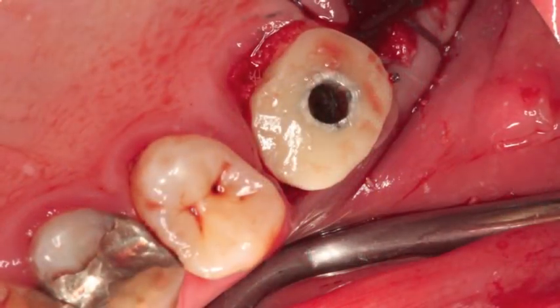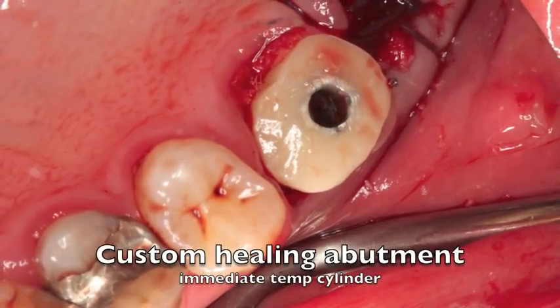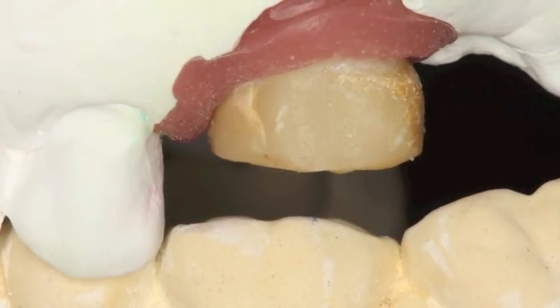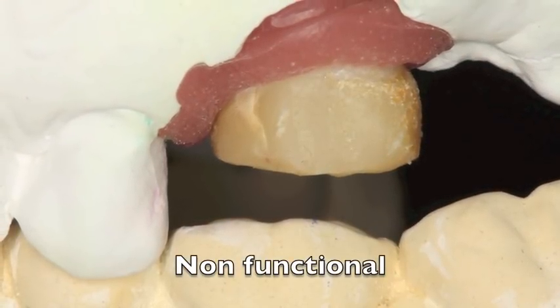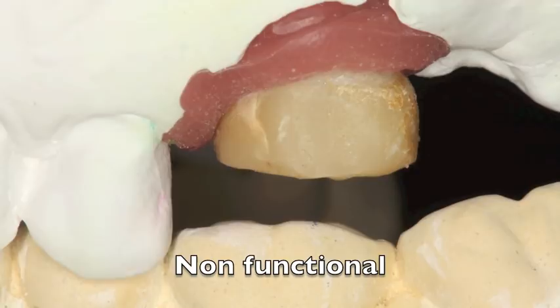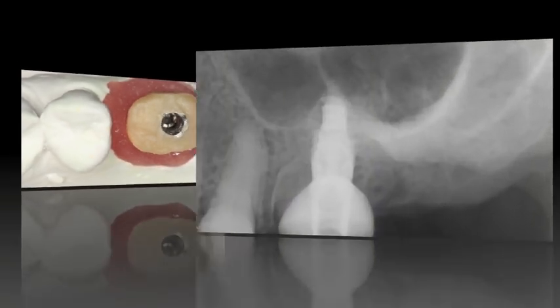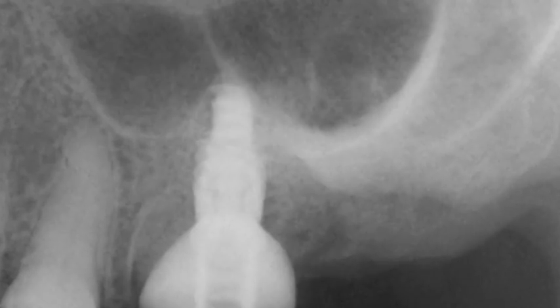Then we put on a custom temporary abutment. I built this out of a titanium cylinder with some acrylic and had it so that it wasn't going to hit into the bite at all. You can see one of the reasons it slid back a little bit is because the septum and the sinus created a little pocket, but it looked really quite nice and was quite firm in this area.